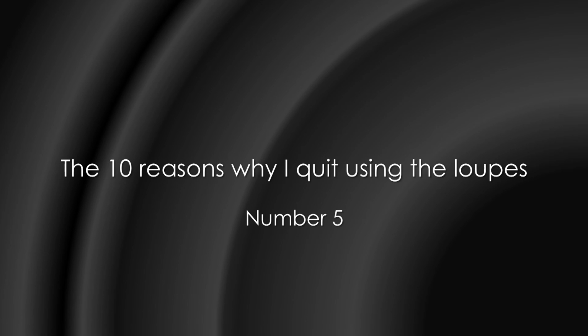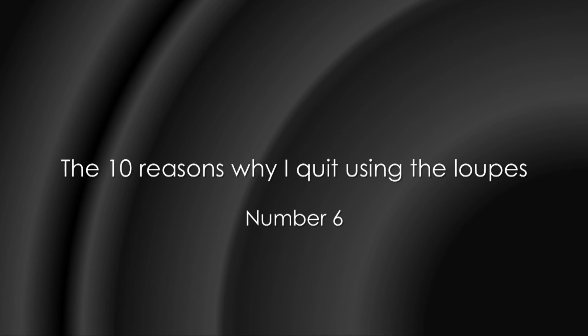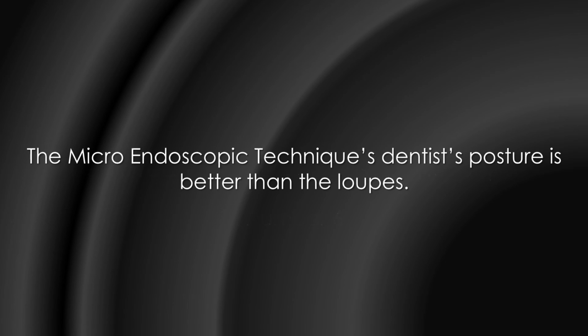Number 5, the microendoscopic technique's ratio of the direct view into the mouth is much higher than the loupes'. Number 6, the microendoscopic technique's dentist posture is better than the loupes'.